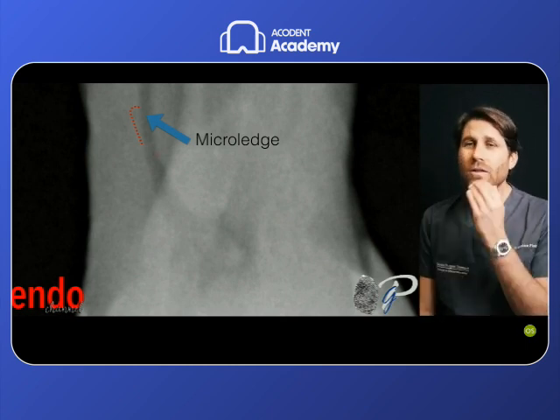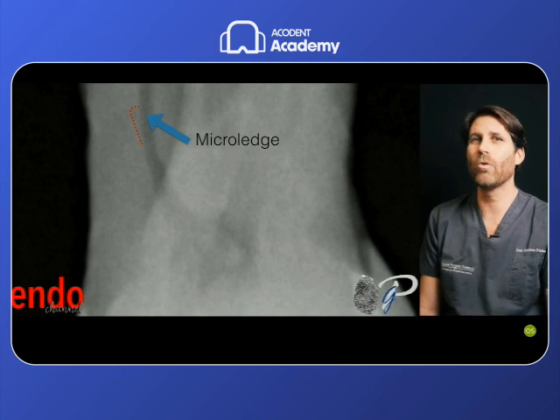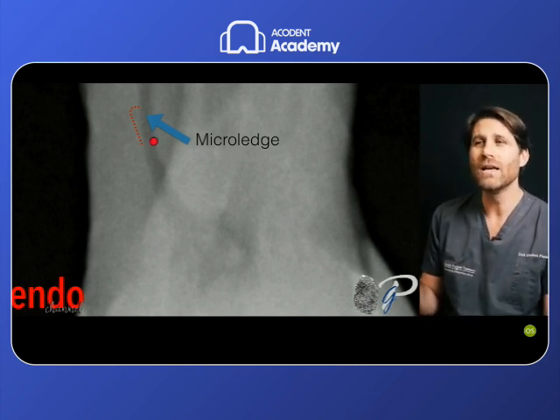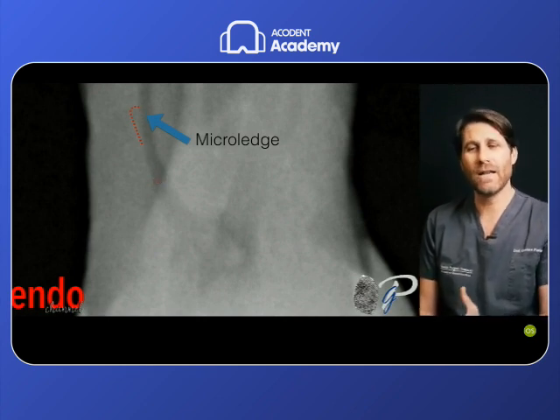So do not insist in these cases with the manual stainless steel file if it does not proceed following a scoutable natural path. Do not insist, because the manual files are rigid, especially starting from the 10, and can create this iatrogenic anatomical error problem that can prevent our scouting in the next phases.